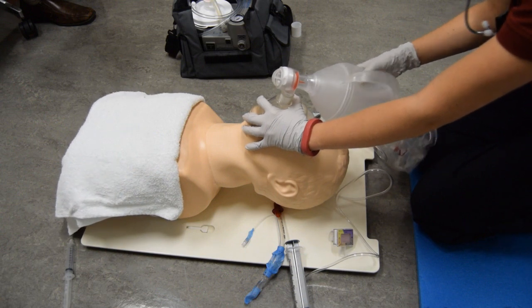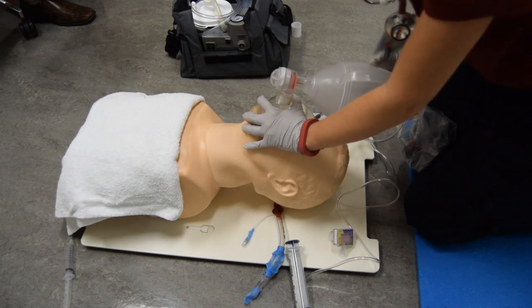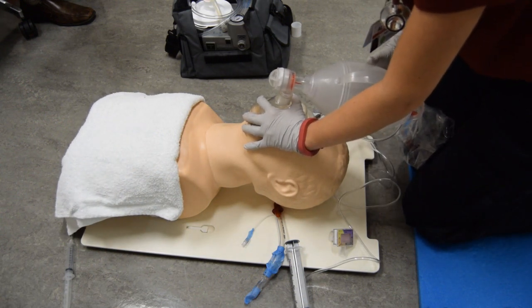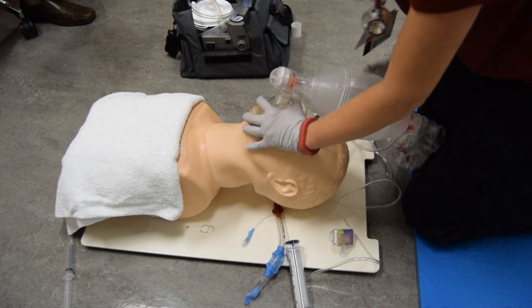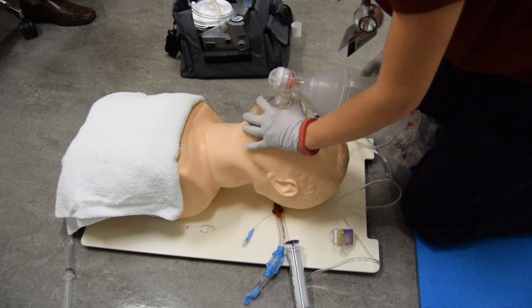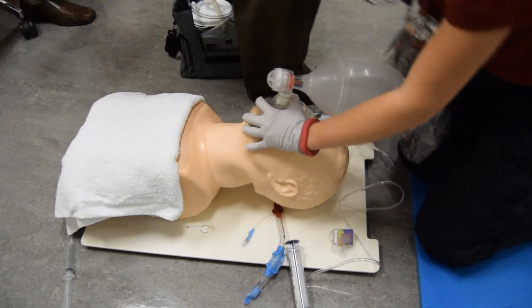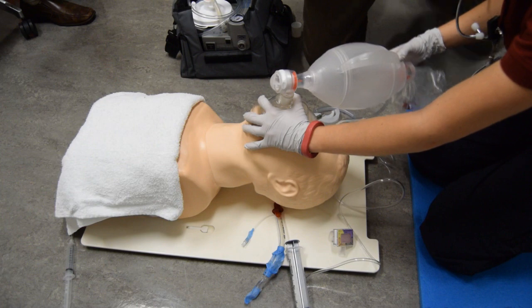After 30 seconds, examiner auscultates and reports breath sounds are present and equal bilaterally, and medical direction has ordered insertion of a supraglottic airway. The examiner must now take over ventilation. Directs assistant to pre-oxygenate patient.